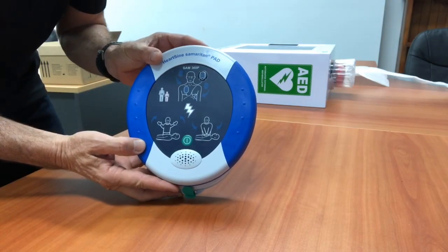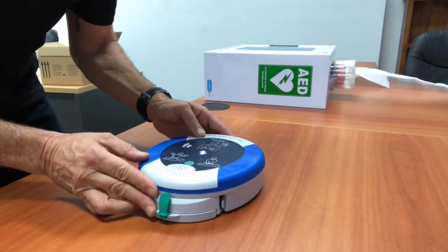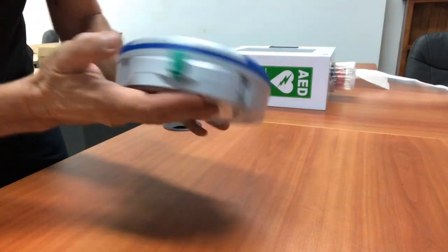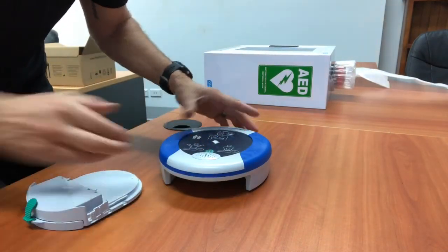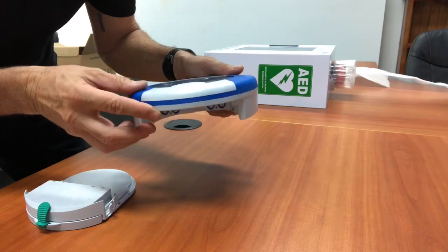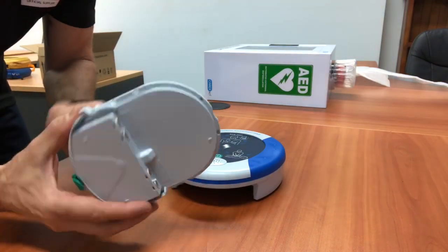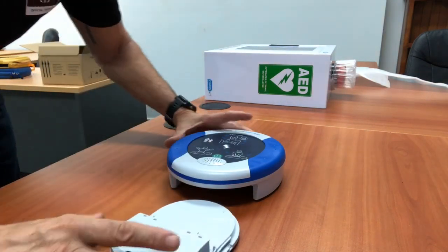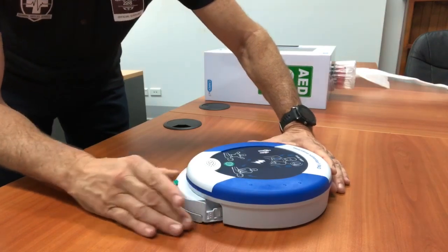To reinstall the new pad pack once the device has been used, or the battery and pads have expired, place the defibrillator flat on a surface. There are two clips on each side of the pad and battery pack — simply unclip and pull it out. That removes the back section, which contains the pads and battery pack in one unit. Replace it with the new pack, note the expiry date and confirm it matches the dates on the Parkrun hub, then plug it into the device, sliding it until it clicks.